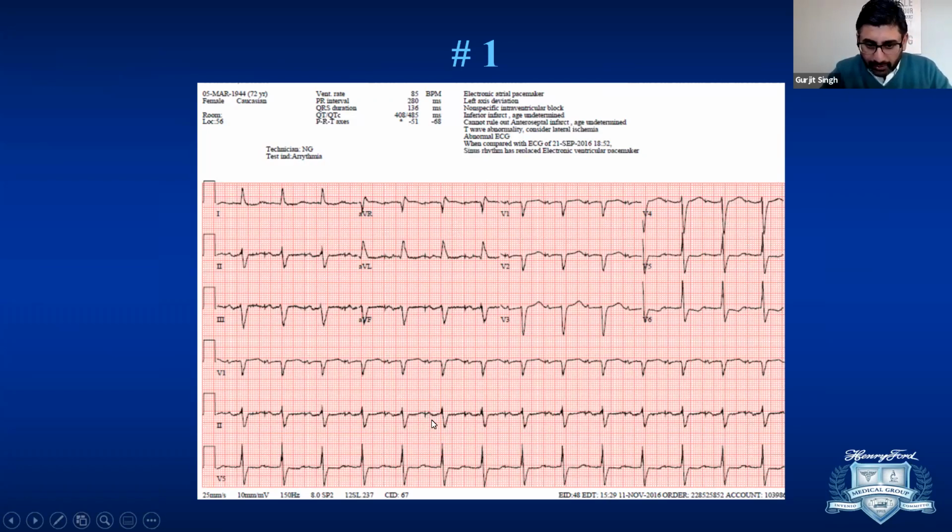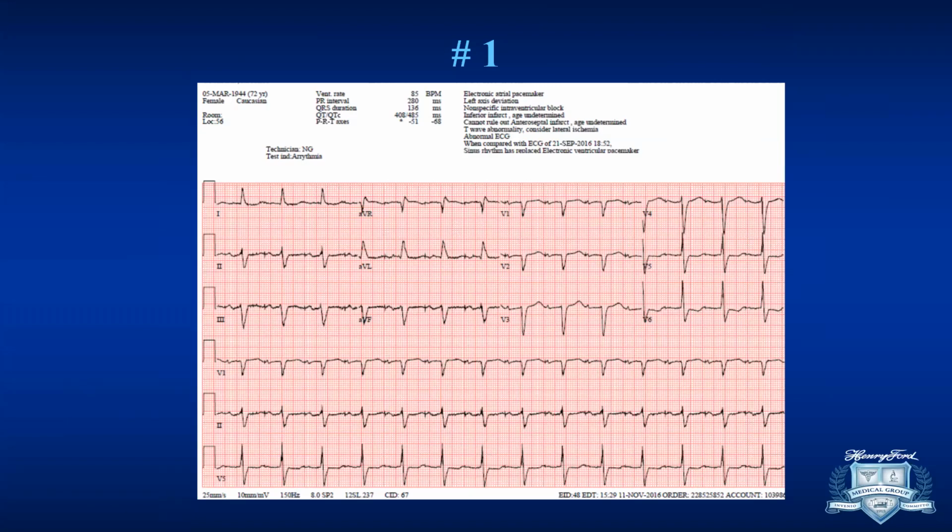Okay, so everybody see here, there's an atrial spike and there's a P wave following the atrial spike. So there is definitely atrial capture. And then, you're muted for some reason. Can you guys hear me? It says I'm muted. Yes, we can hear you. Okay. So you see an atrial pacing spike, and definitely there's atrial capture, and then there's a QRS.